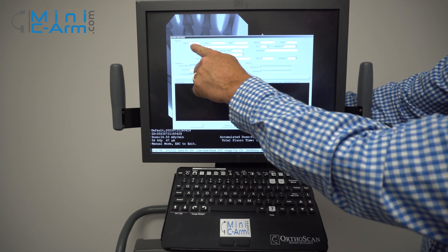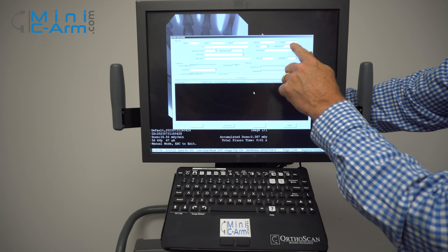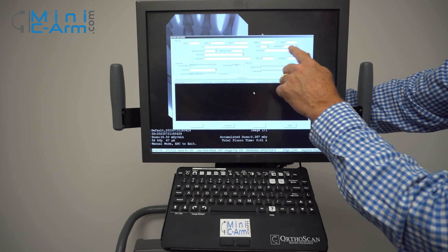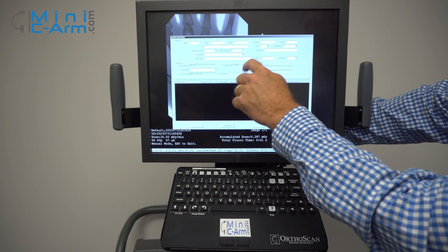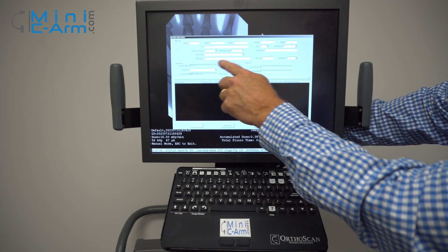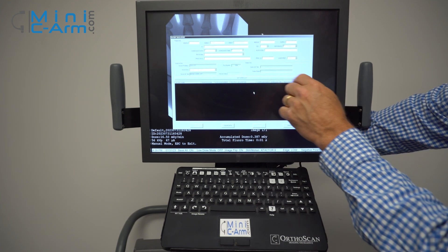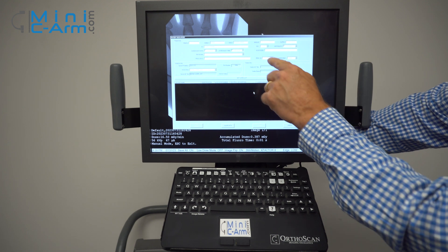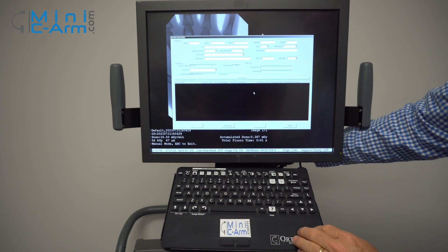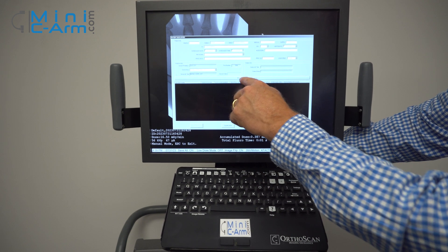You have your prefix, family name, first name, middle, suffix. You can change the sex, birth date, patient ID, scheduled date, and physician. You can also type in your description of your case, your session number, and put in your procedure ID. You can also download your work list.